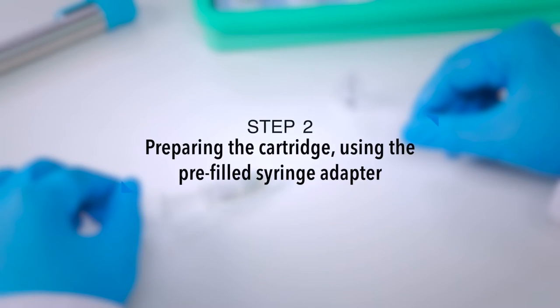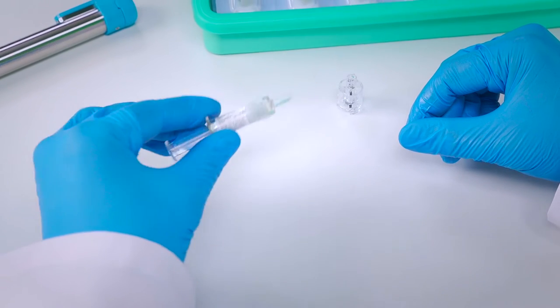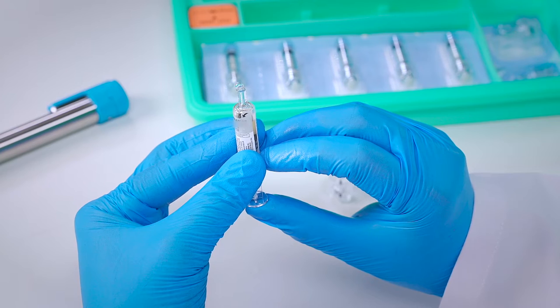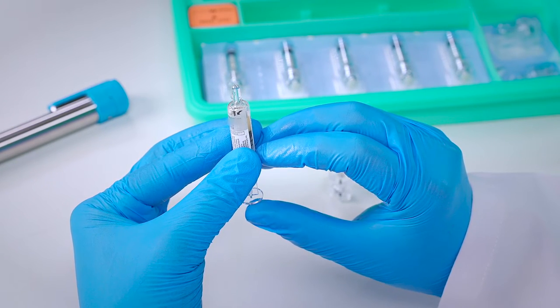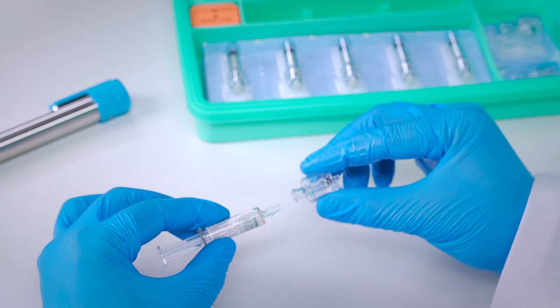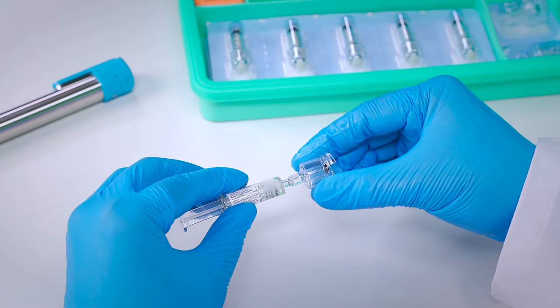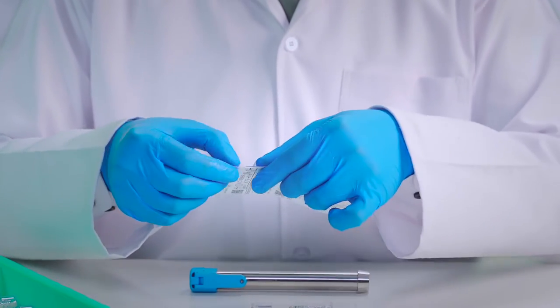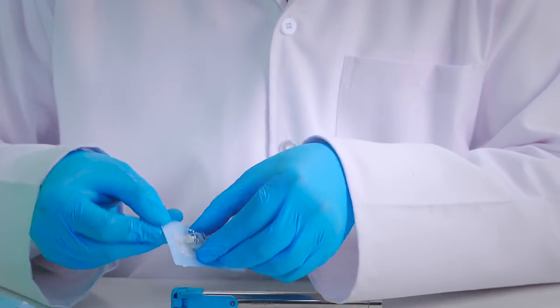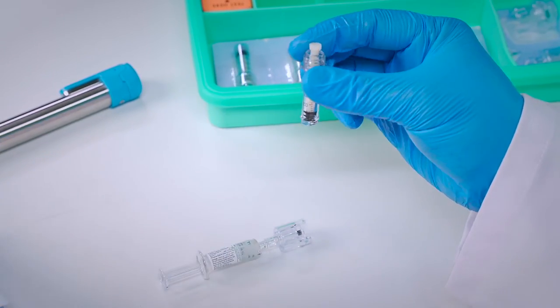Step 2: Preparing the cartridge using the pre-filled syringe adapter. Take the medicinal pre-filled syringe, open the cap, and remove any air bubbles present. Attach the Integri Medical pre-filled syringe adapter by twisting it onto the tip of the medicinal pre-filled syringe. Ensure the connection is secure and tight. Now remove the cartridge, making sure to remove it from the screw end and not from the tip end to ensure sterility.